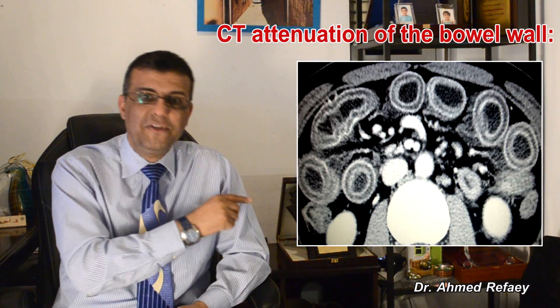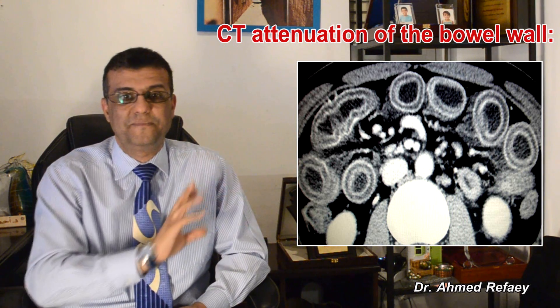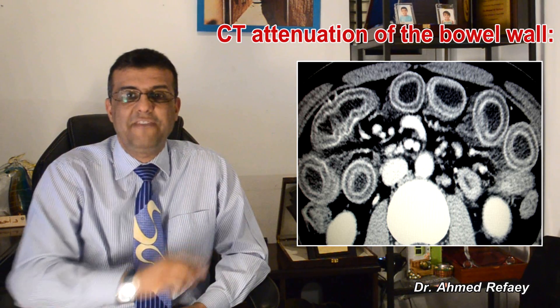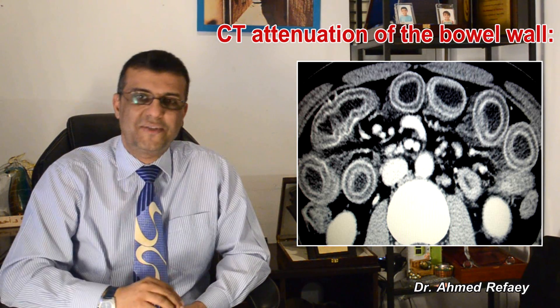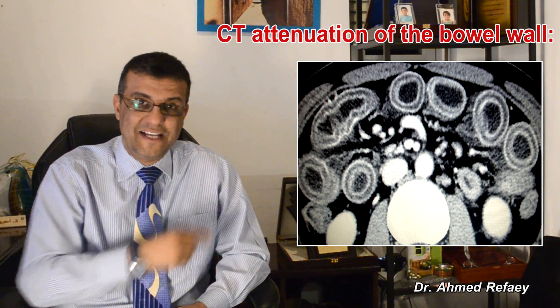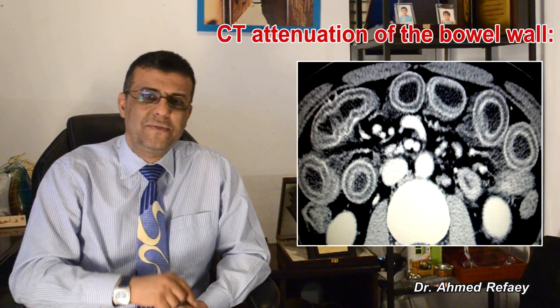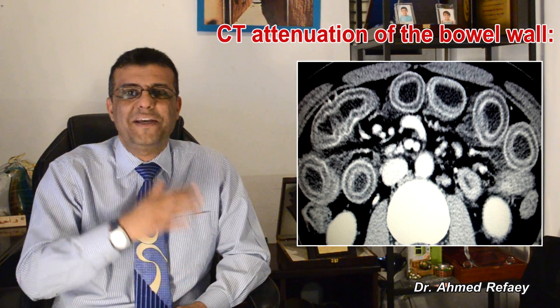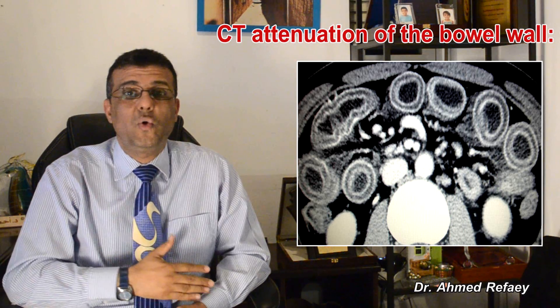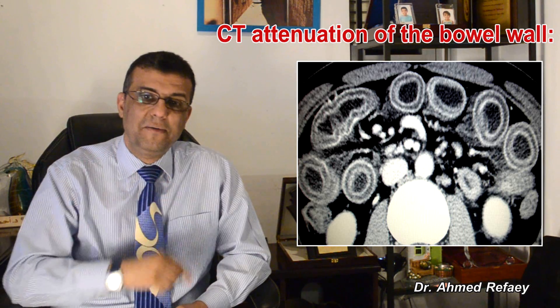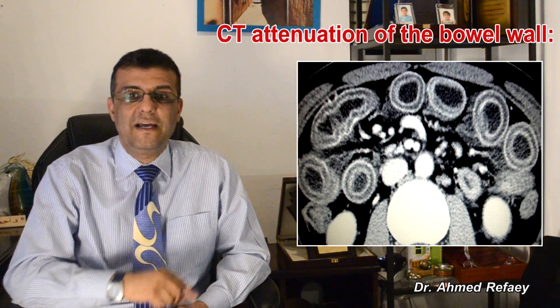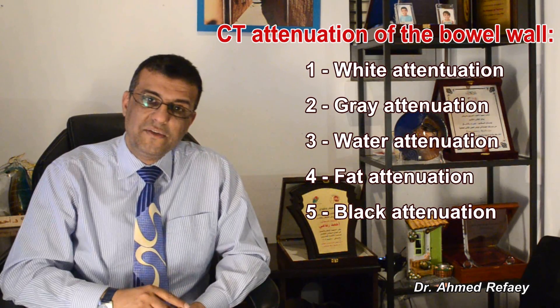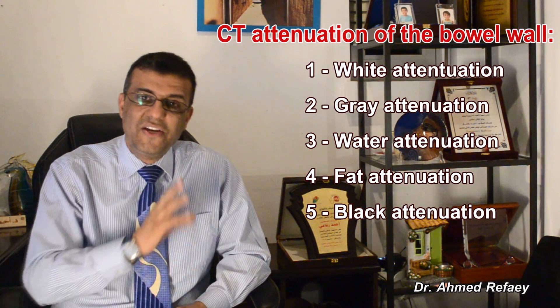The third category is water attenuation. As you see in this image, there is fluid attenuation of the submucosa with enhancement of the mucosa and serosa, giving the appearance of a water halo sign or target sign. The differential diagnosis in cases of water attenuation is wide and can include all types of colitis; however, inflammatory bowel disease and ischemic bowel disease are at the top of the list.